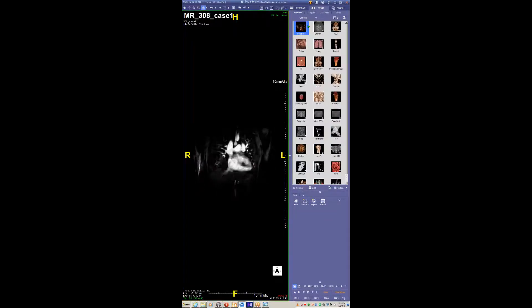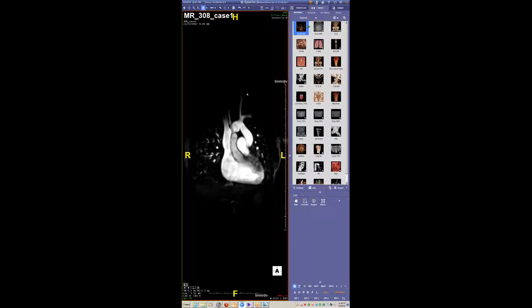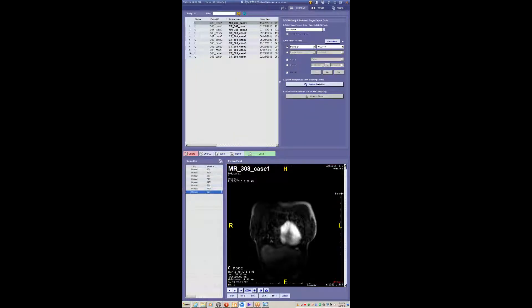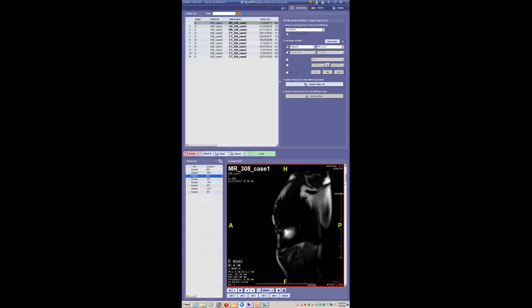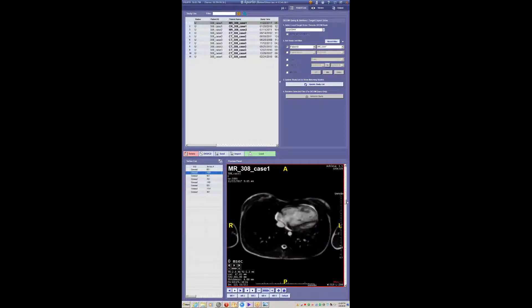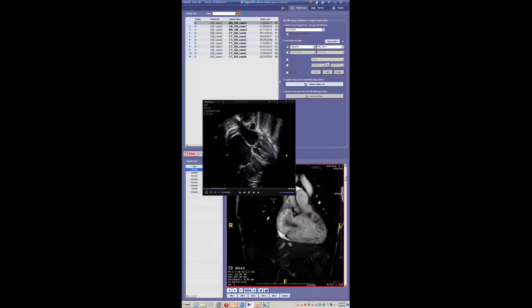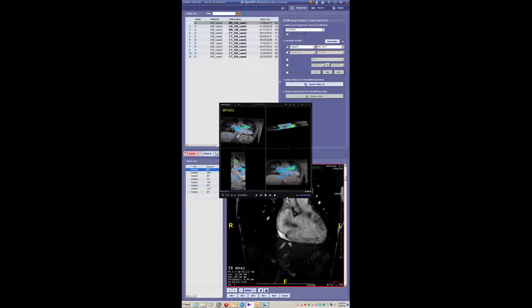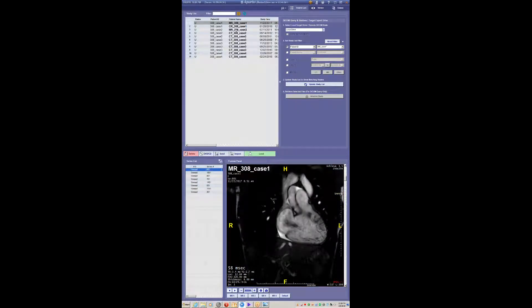The levoatrial cardinal vein — we see it sometimes in congenital cases as a method of decompression when patients have some sort of LV or left-sided obstruction. That connects to the left brachiocephalic. You can see via the arrows that it's going up and up and around. Just a really neat case. And then just a fun case on call — this person had calcification sitting in the left atrium. The left atrium is large with a slightly atypical morphology. Went back and looked at old abdomen pelvis CT from a couple of years ago, and you can see a little calcification here, linear — I was like, it's got to be another cor triatriatum.